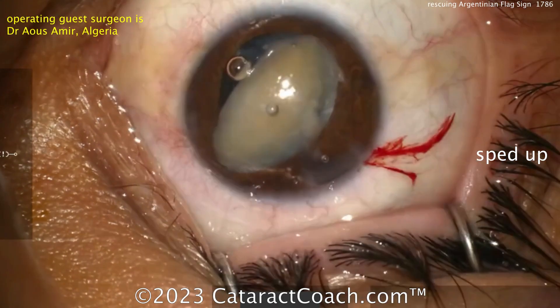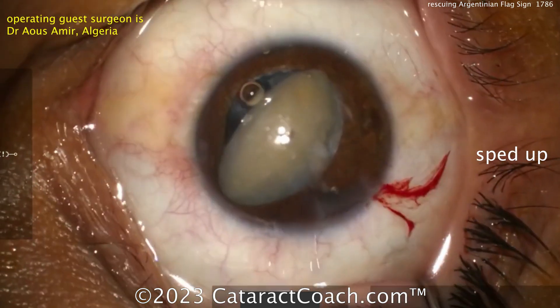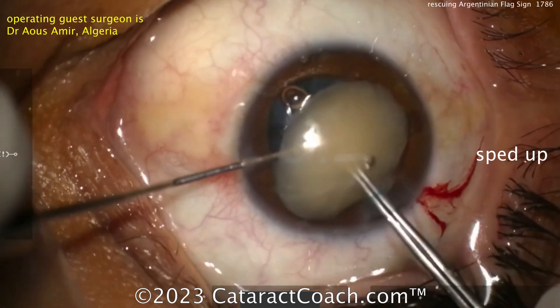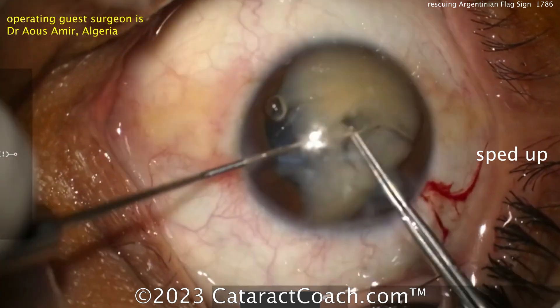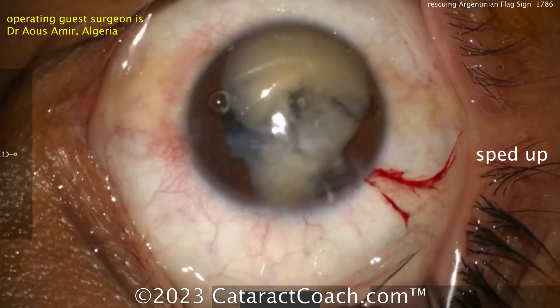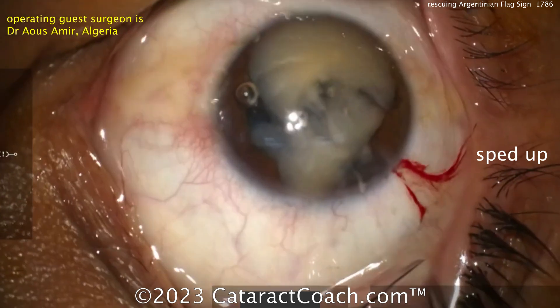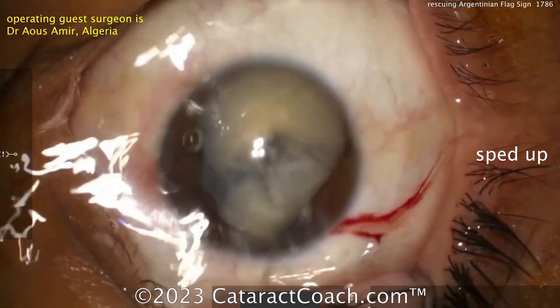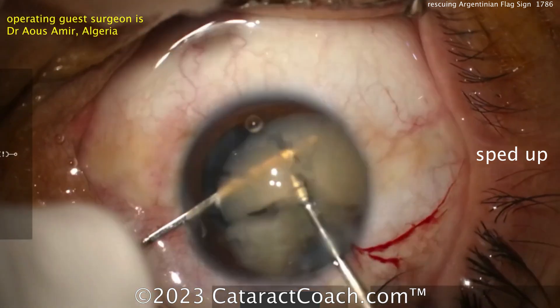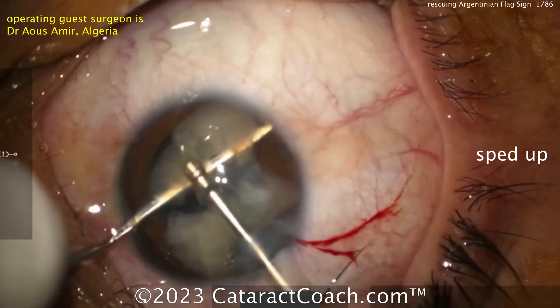Nucleus up out of the bag — I like it. I don't want to operate in the bag as much because any pressure, like trying to crack the nucleus in half, can propagate that rip to the posterior capsule. I like the technique here: using a forceps and a chopper just to poke into it and split it. Fantastic — a manual split of the nucleus there in the anterior chamber. Not a terribly dense nucleus, so you should be able to aspirate this down pretty easily. Phaco probe going in, pieces are there for the taking.